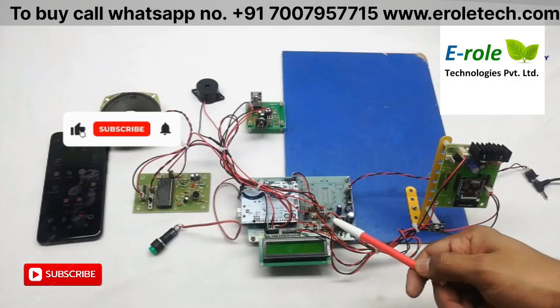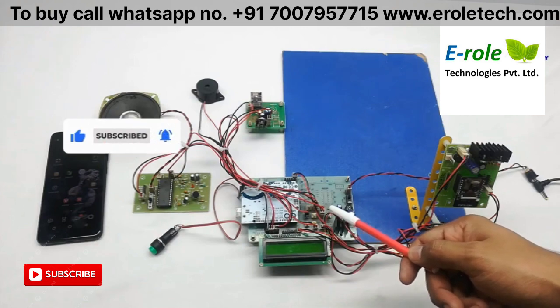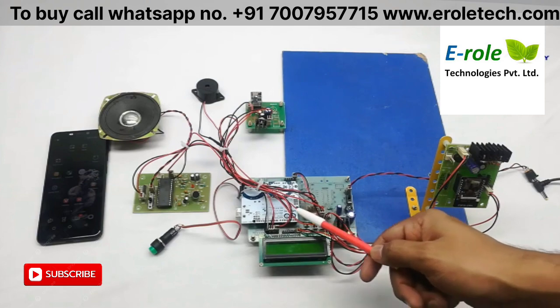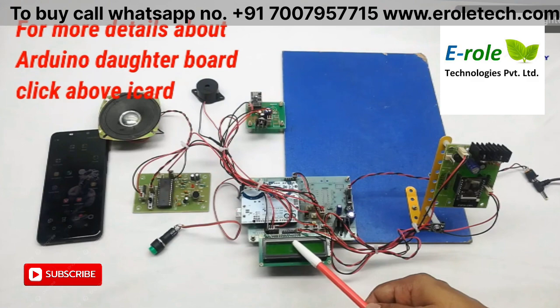This project is face mask detection and thermal screening with audio response for COVID-19 with IoT. Here, hardware connections are Arduino and its daughter board along with power supply and a 16x2 LCD display.